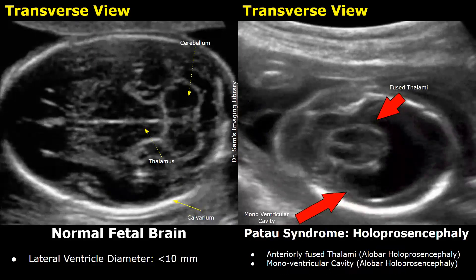The most common abnormality associated with Patau Syndrome is holoprosencephaly. In this abnormality, the cerebral hemispheres of the fetal brain fail to divide into two separate cerebral hemispheres. It is a very severe and serious anomaly. Instead of two separate cerebral hemispheres, a small, abnormally developed brain tissue is seen. The most serious form of holoprosencephaly is alobar holoprosencephaly. In this type, the brain tissue completely fails to divide into two separate cerebral hemispheres.